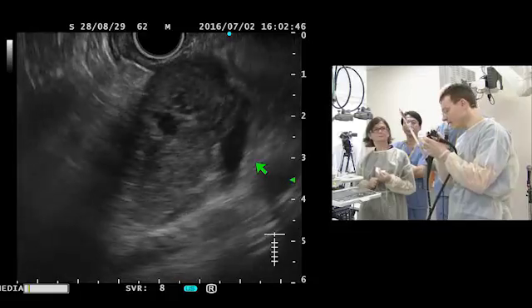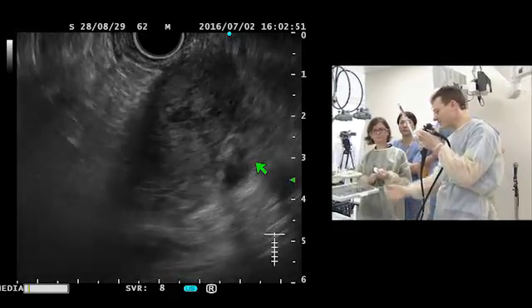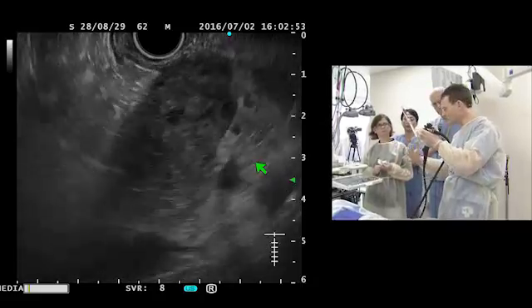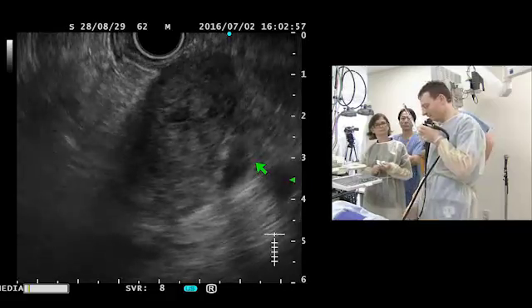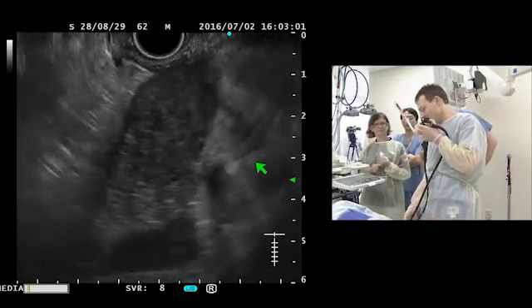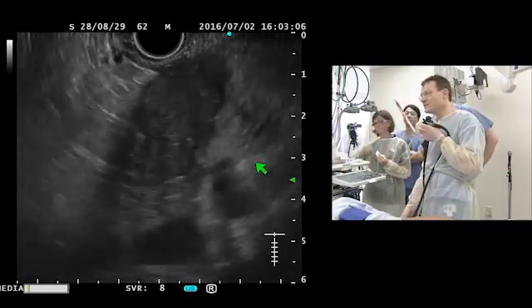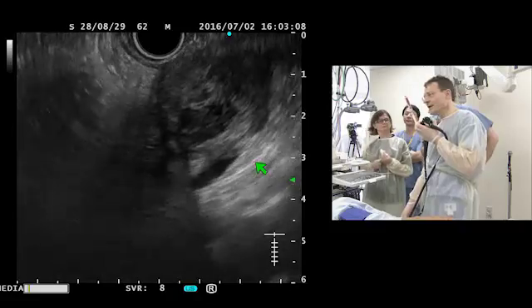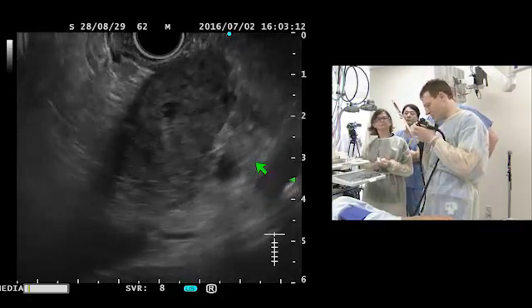And here in this situation, in the area of the stomach, sometimes we bounce back because we have a lot of space, and so the position of the scope is sometimes unstable. I perform a little bit inward pressure, and I put the scope here on my body to have a more stable position, because you will notice that we will have some problems in this puncture.